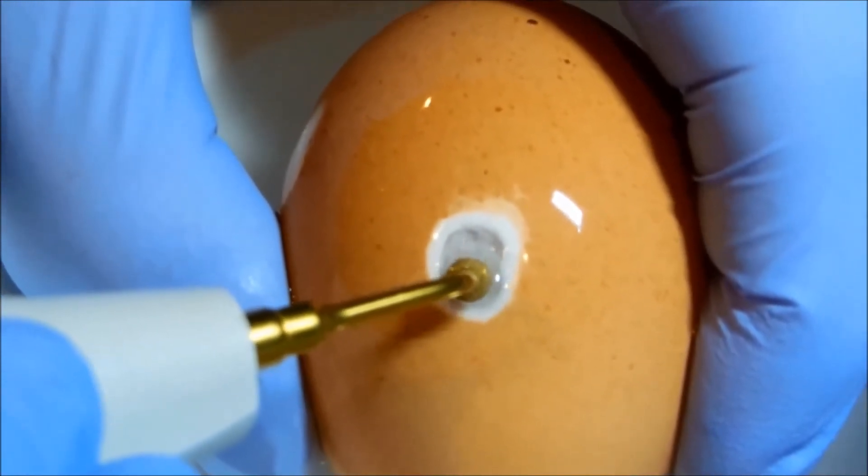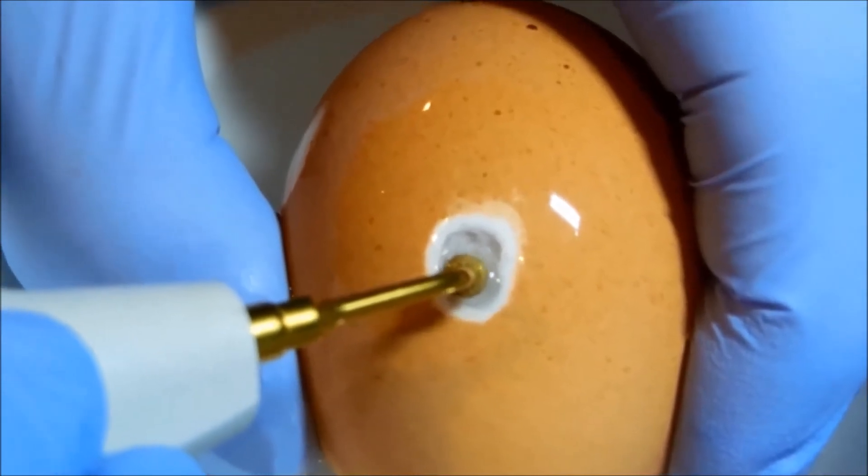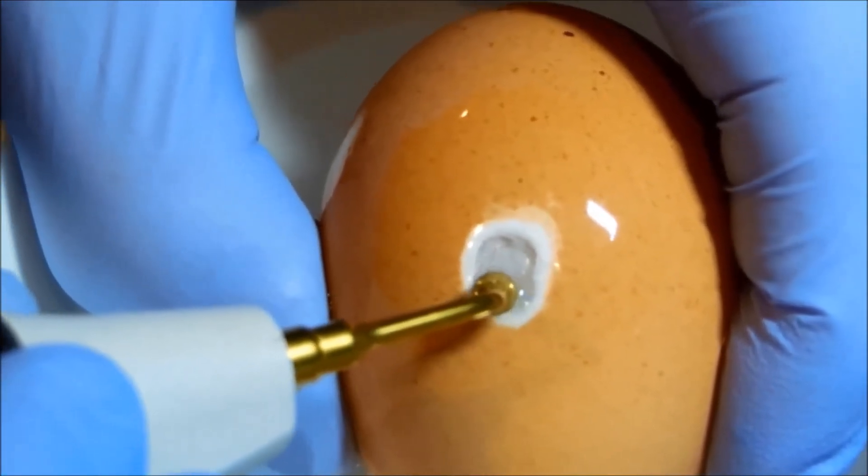So what you're looking at here is really soft tissue. You can see how I'm pushing against it. And it's all intact.